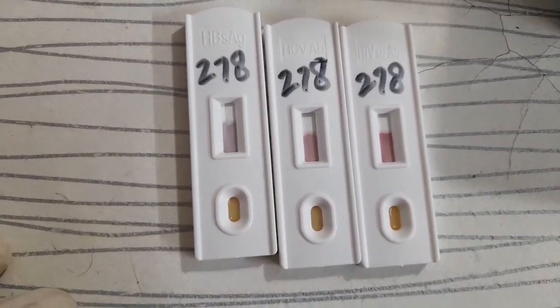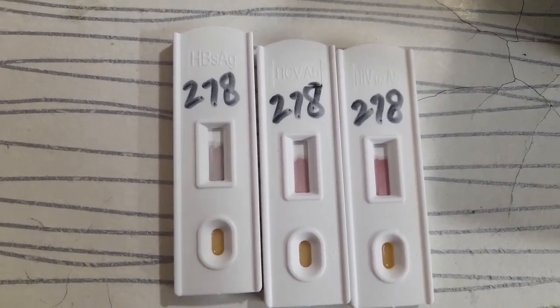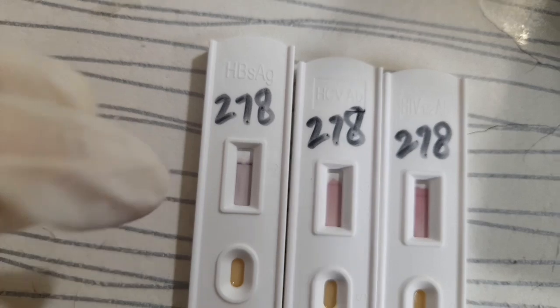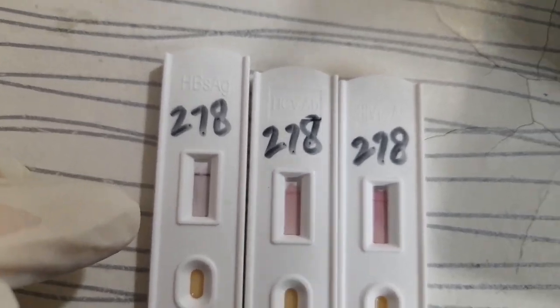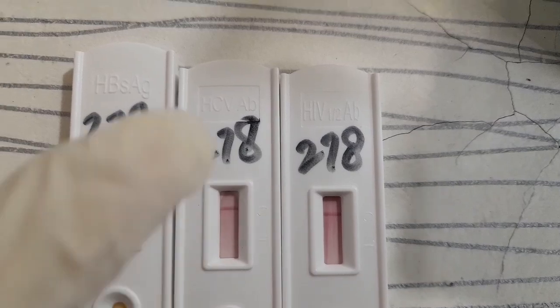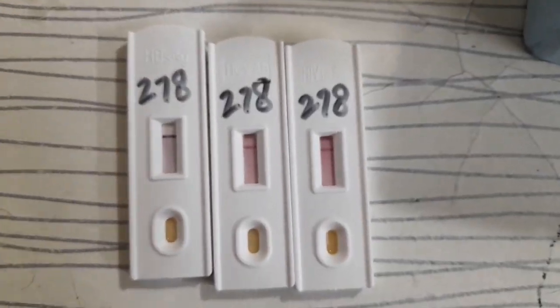Now you can see there are two lines if the test is positive. The first one is the test line and the other one is the control line. If the control line is shown, it means the test kit is valid and the test is valid. If the control line is not shown, it means the test is not valid.